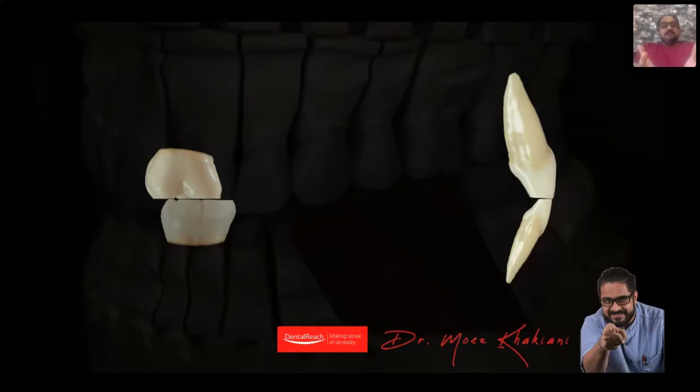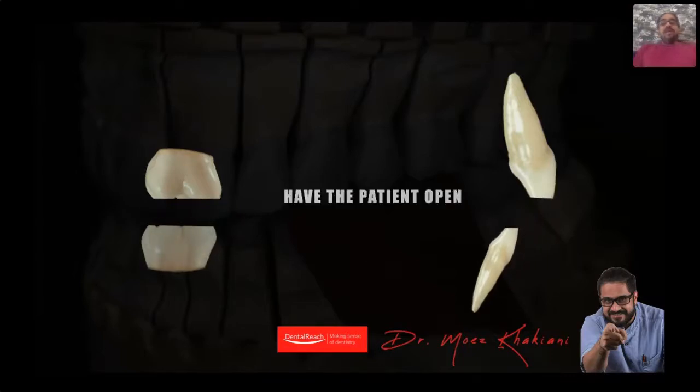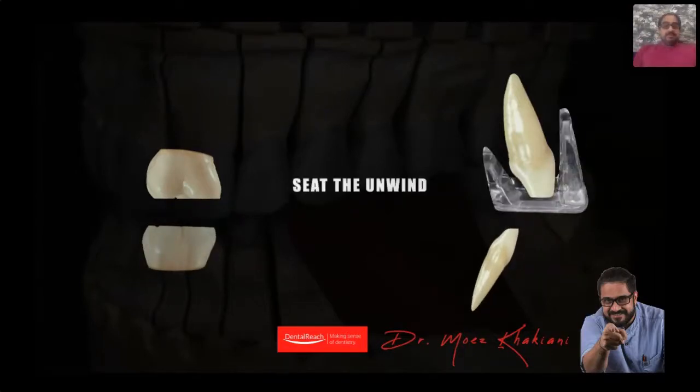This is very similar to, remember reading a pseudo class 3? The anteriors go into a cross-bite relation because there is an interference. Bruxers who come edge-to-edge almost always are in a forward position. So how do we take them into correct CR? We ask them to open their mouth. We now put in the Unwind MD. This is the anatomic position in which Unwind MD goes in.